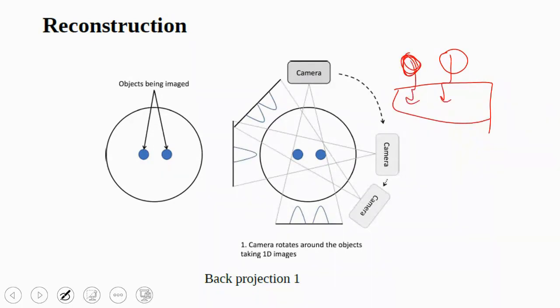So, if you took these signals and recorded them in a large pixel, can you doctors distinguish whether this signal is coming from this object or that object? You won't be able to. Therefore, the pixel size must be small, so we need to divide this large size into smaller parts to differentiate each pixel and distinguish the 2 signals coming in.